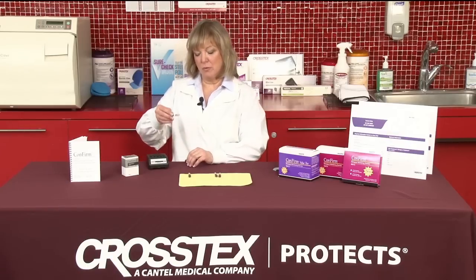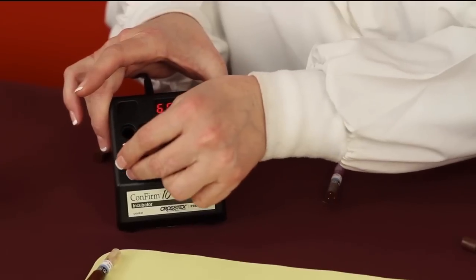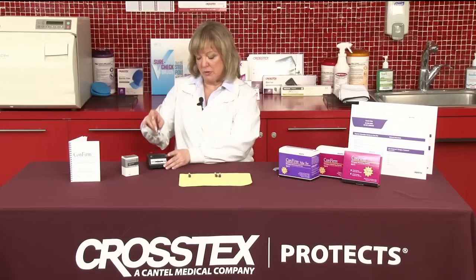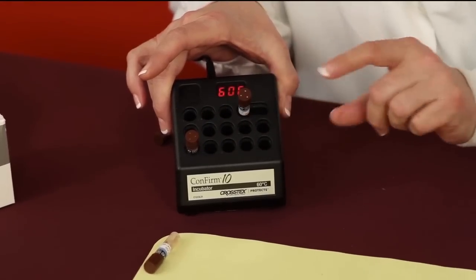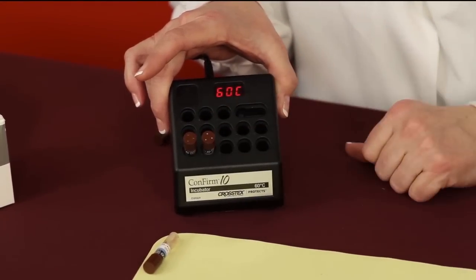At that point, we're going to put our test vial into one of the wells. We're also then going to take the control vial that was not processed. We also have to release the fluid, so it would go into the crusher. We pop it, and it would be placed next to the test.